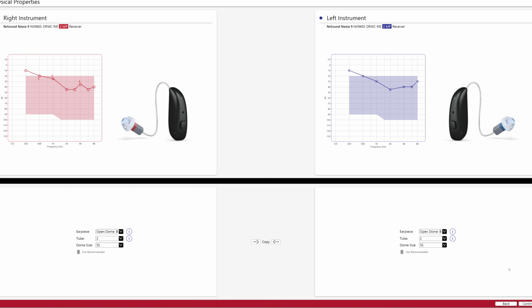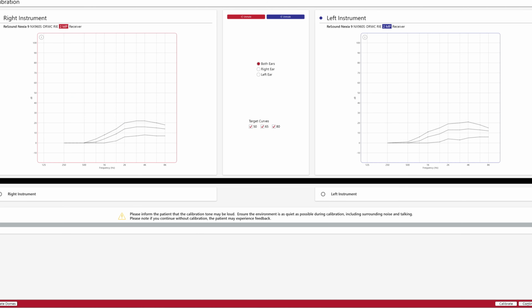It's important to make sure that you've got your Bluetooth turned off though if you're taking the Nexias in to be reprogrammed, as otherwise you'll have your audiologist panicking that they are broken. It's only happened a few times. It tends to be on Friday afternoons.